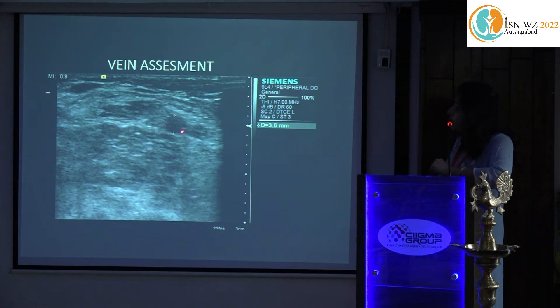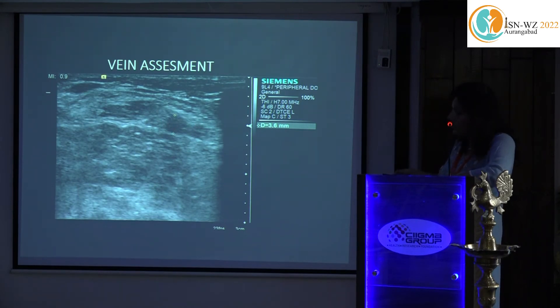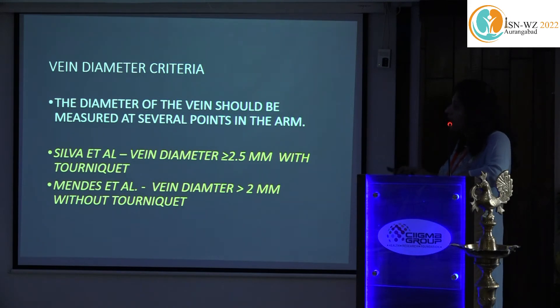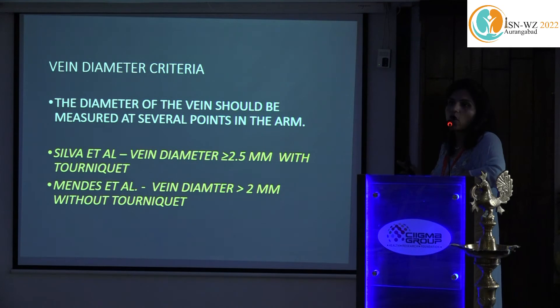This is how a normal vein looks. The cephalic vein at the wrist shows a very thin wall with an anechoic lumen and is completely compressible. The measured diameter here is 3.6 mm at the wrist — a very good diameter. Studies frequently cited recommend a vein diameter of more than 2.5 mm with tourniquet, or at least 2 mm without tourniquet, as criteria for fistula surgery.